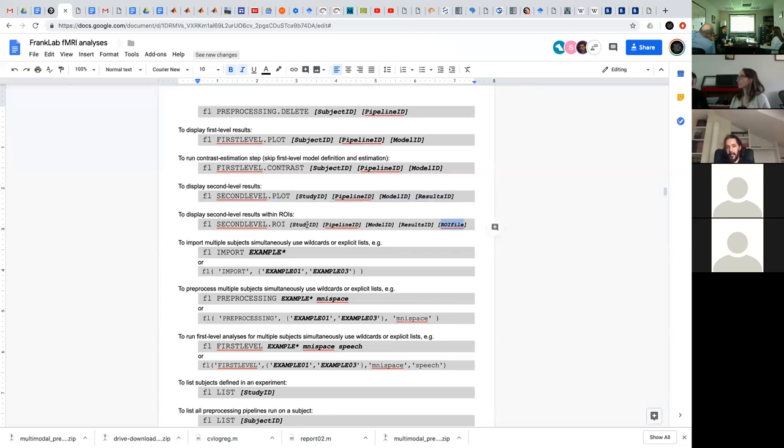So to some degree it's not totally appropriate to still call it MNI 152. I think most people just use MNI to refer to one space, and they no longer care about the minor differences between those MNI implementations, whether it's FSL or SPM.